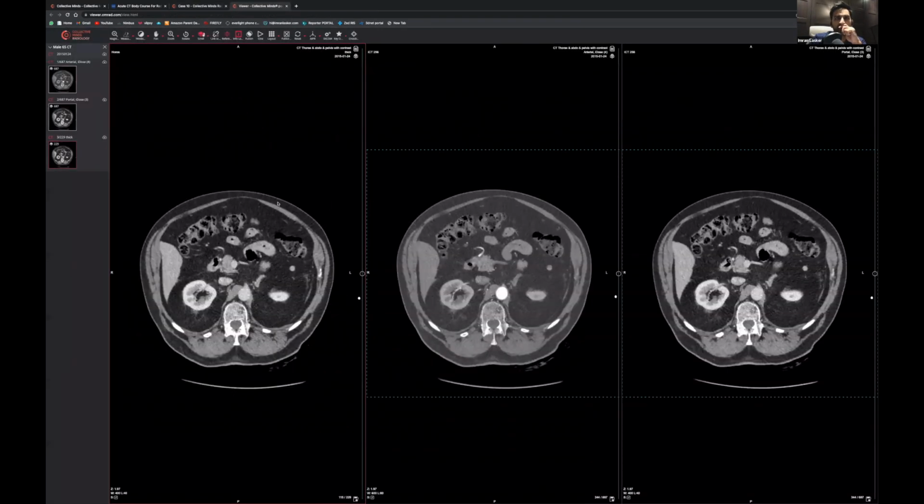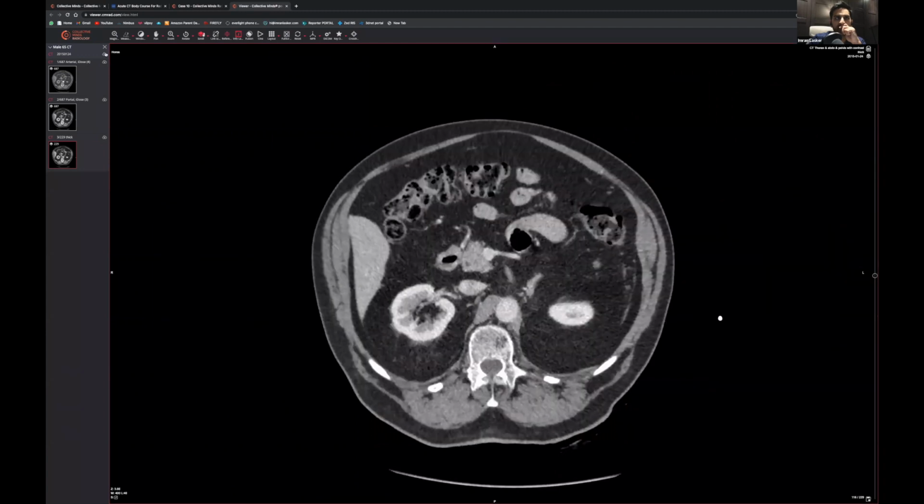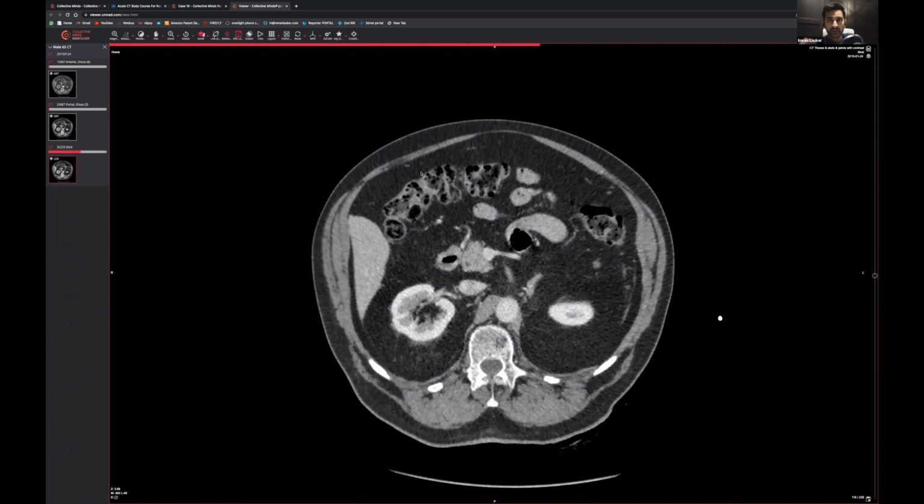Oh, we're going to put this one in. Okay, fine. If this is the one I think it is. Okay, fine. Let's put this through. So I'm just going to download it. It's coming up. Wait for that red line to go all the way across.